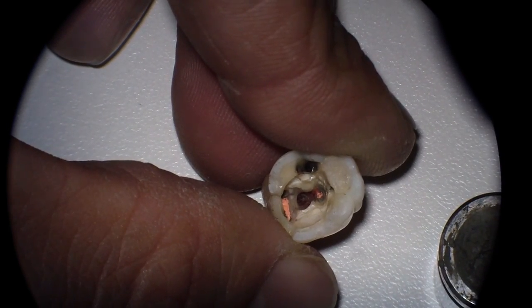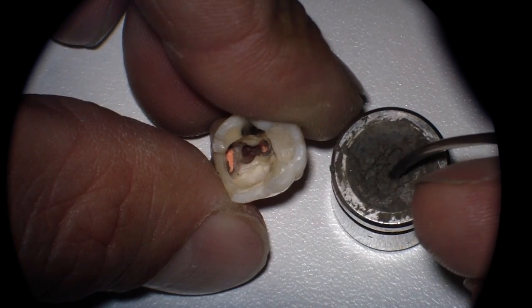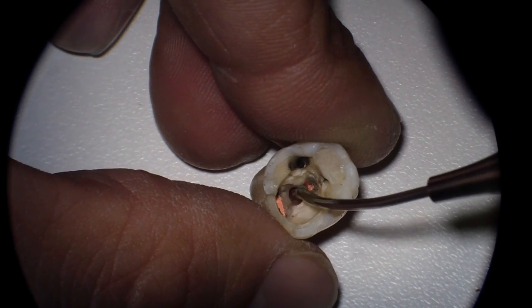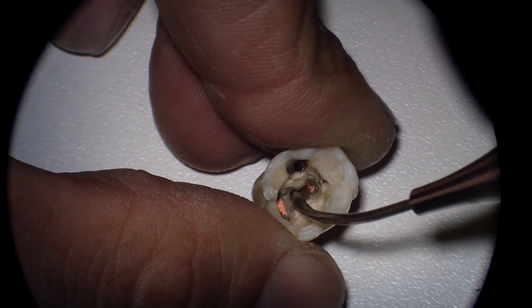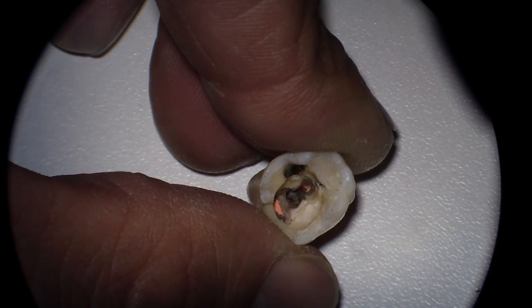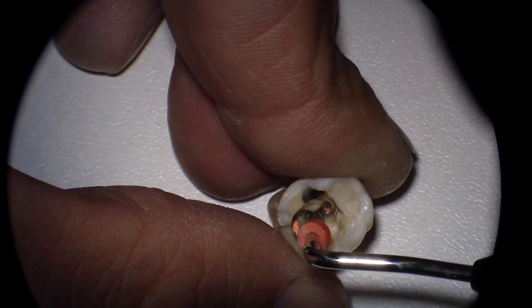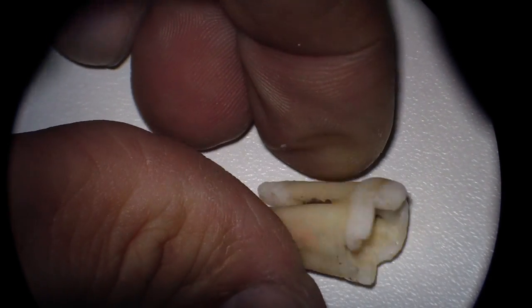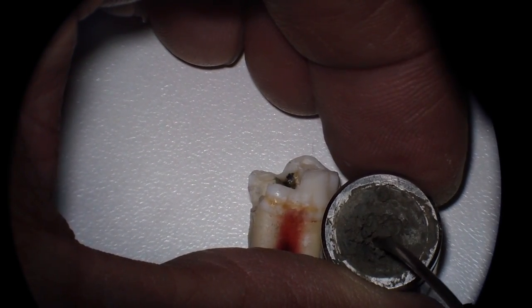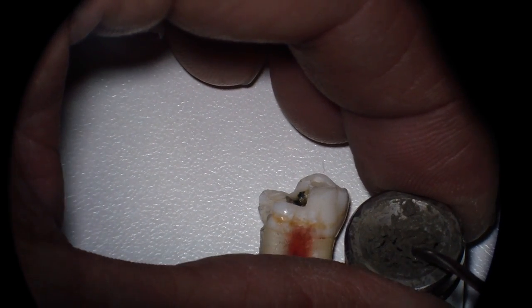Then we have our MTA in our little daffin dish. Place it into our carrier, and then go ahead and place it into that perforation. Then take a condenser and condense it in.